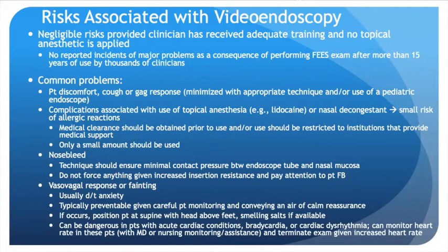That being said, some of the minor common problems that do exist include minor patient discomfort. Cough or gag response is pretty common. And this can be minimized with appropriate technique and/or use of a pediatric endoscope, so an endoscope with a smaller diameter. There are some complications that are associated with the use of topical anesthesia. Lidocaine is a common one.